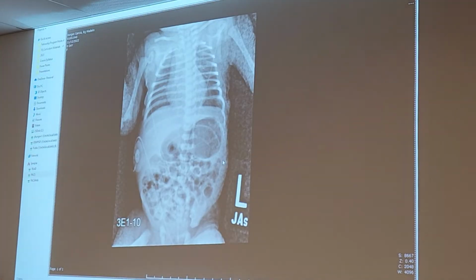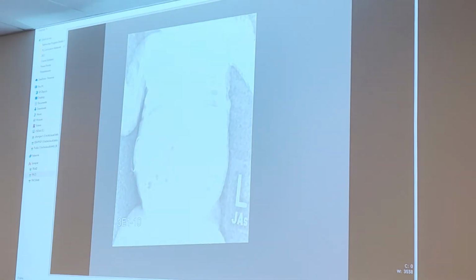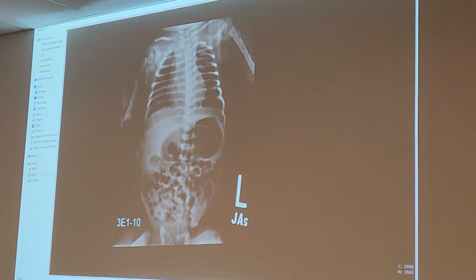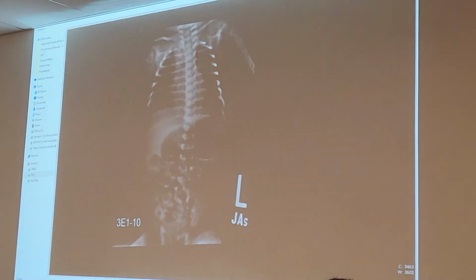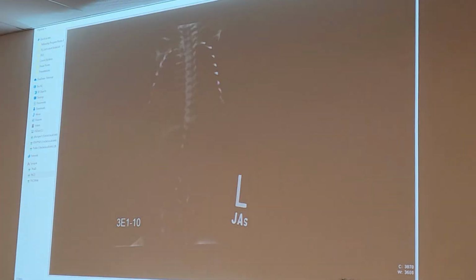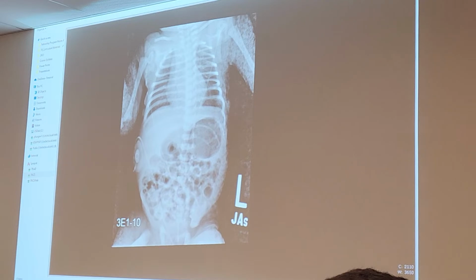All right, so I've got a picture here. Terrible picture. So I am going to adjust my digital window level. For example, I can make the whole thing dark. I can make the whole thing bright. Do you see that? So I am adjusting what? Leveling. So does this fall under brightness or contrast? Brightness, very good.